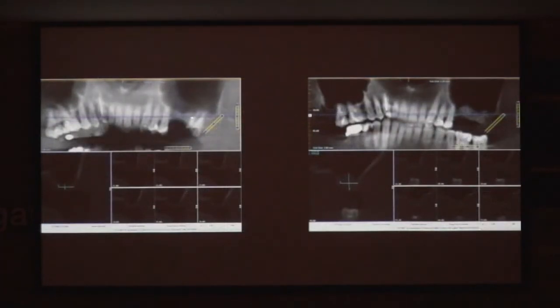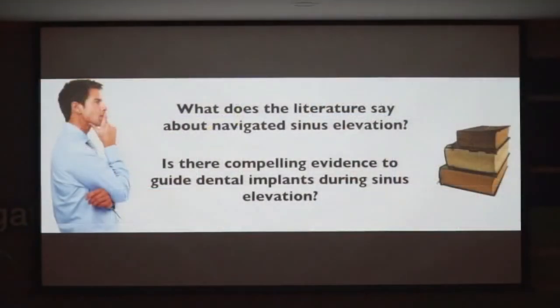And I'm taking this tooth out, and I actually measured 2 millimeters of bone here. I don't want to put in an implant. They'll tell you that with 2 or 3 millimeters of bone, you can generate 10. So what I did was I just grafted this, and then I augmented that, and it's about 9, 10 millimeters of bone. And then I'm going to go back and put in an implant and do some more. So let's look at some evidence.